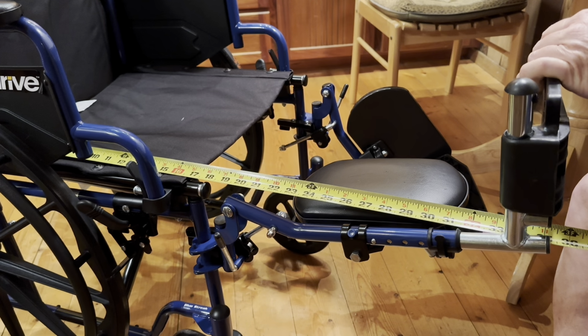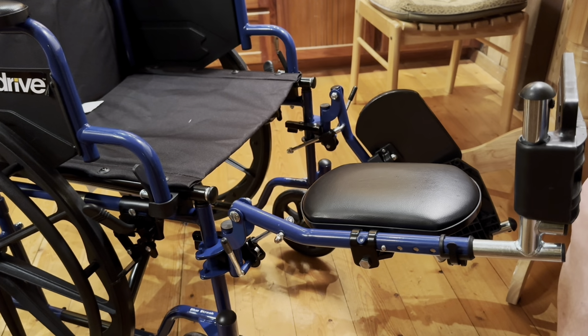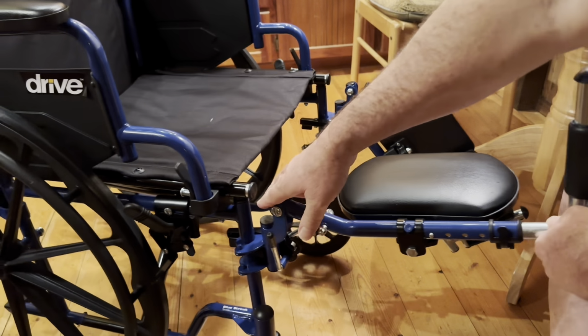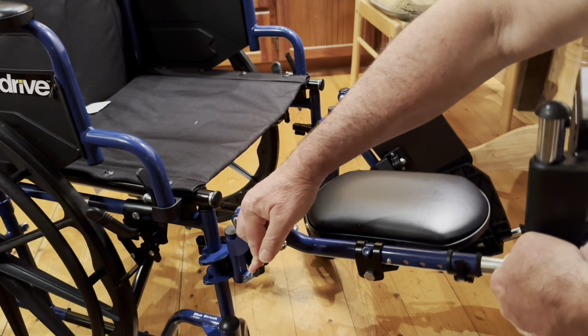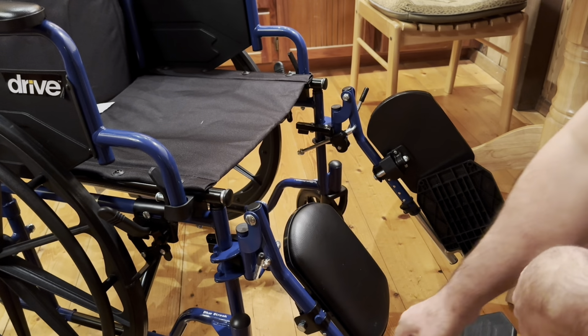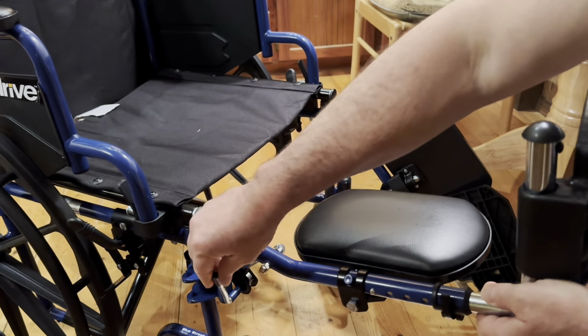Okay, I would not be able to fit in there unless I folded that up. I like the design, I just don't think these legs are long enough. To put the leg down, let's see if I can remember, you push this forward, that releases the lock for the leg. And to lift it up, you just simply pull it up. Okay.